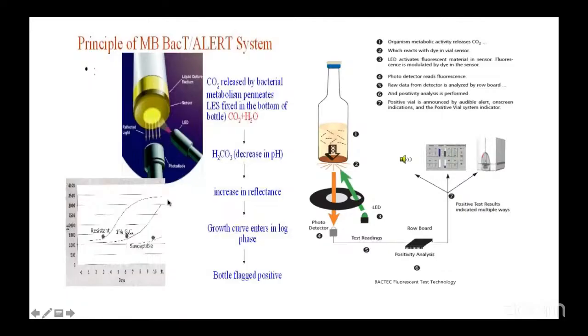So I'm just going to talk a little bit about them as to how they work. Now, on one side is your BacT/Alert, that is on my left hand side, and then my right hand side is your BACTEC fluorescent test technology.